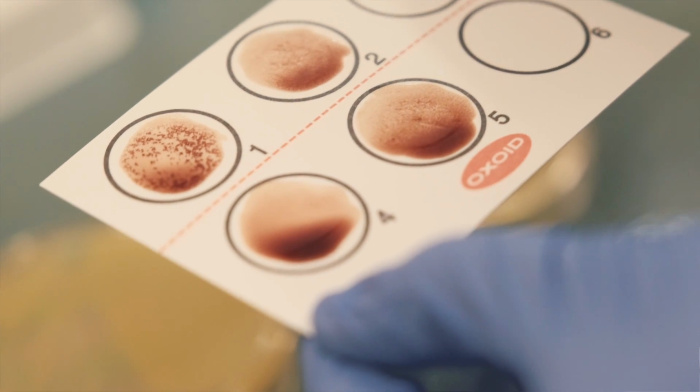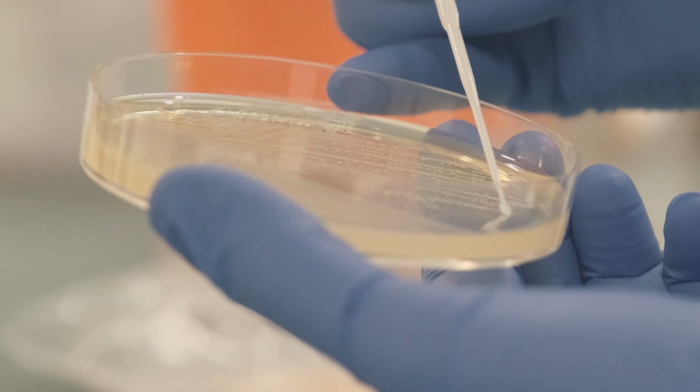The foundation of culture-based testing relies on growing and isolating microbes in culture before conducting follow-up diagnostics. This means that it is slower and less sensitive than modern molecular and genomics approaches, but it is by no means obsolete. Culture-based testing remains the gold standard to confirm the identity of specific types of microorganisms, and we will go through the process from first principles.